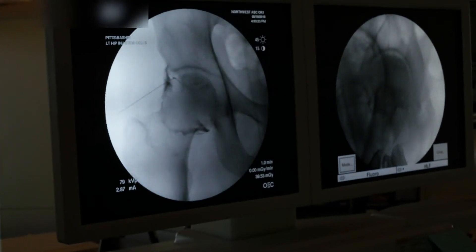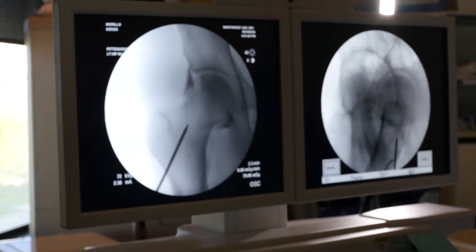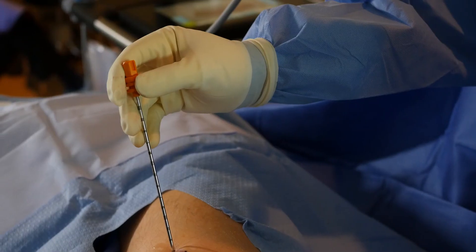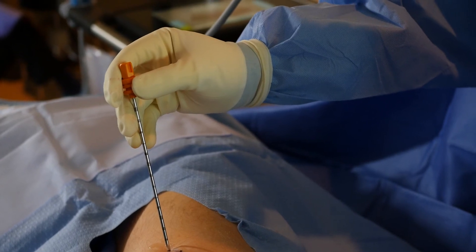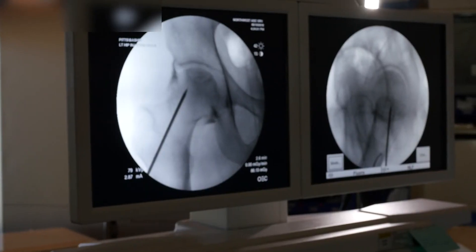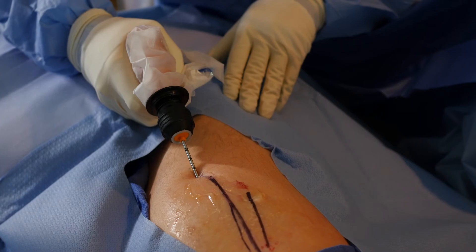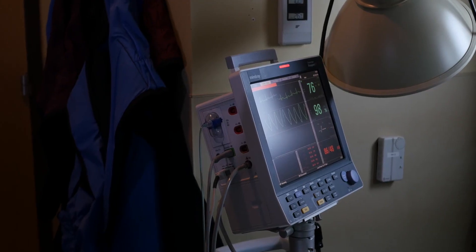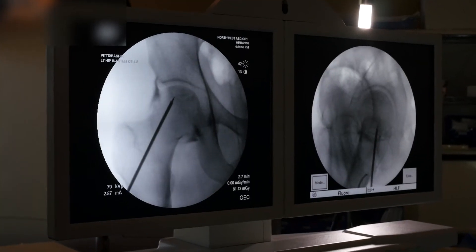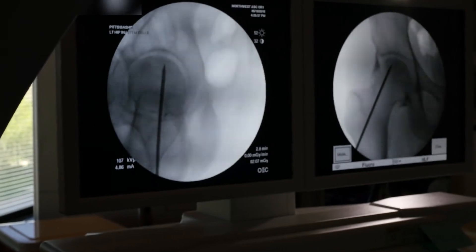So now what I'm doing is I have my anterior-posterior dimension. If you look at the screen we've got the placement of where we're going to put our trocar through the femoral neck. About to crack through that — it's right in there. Now we're going to put some contrast into the lesion.